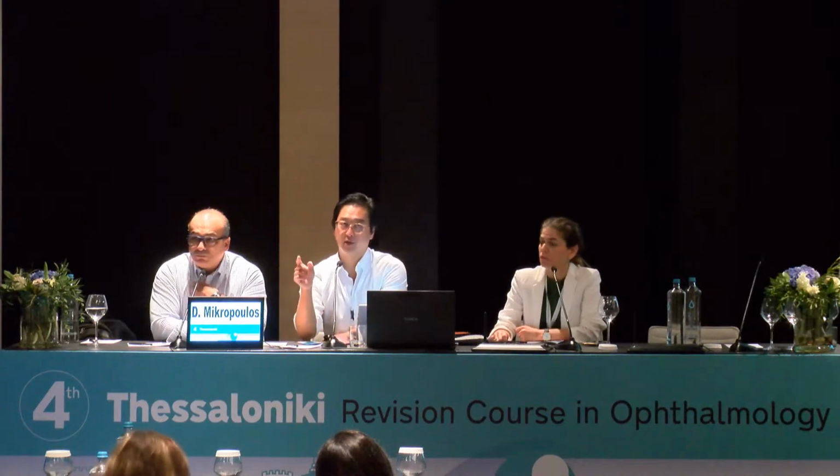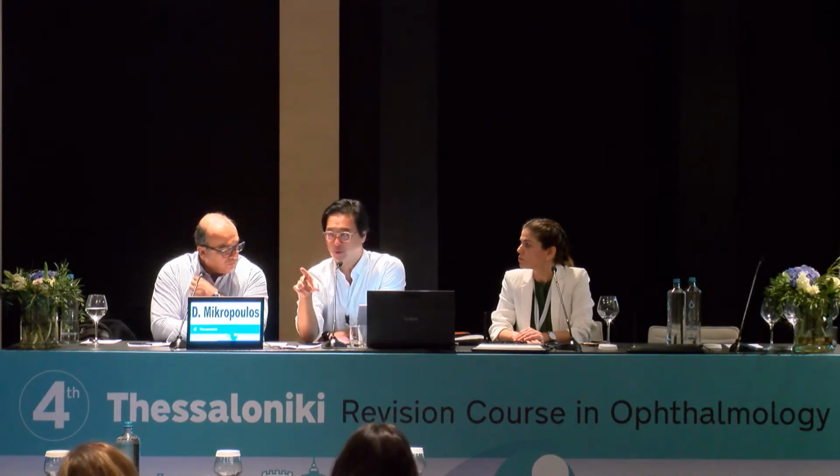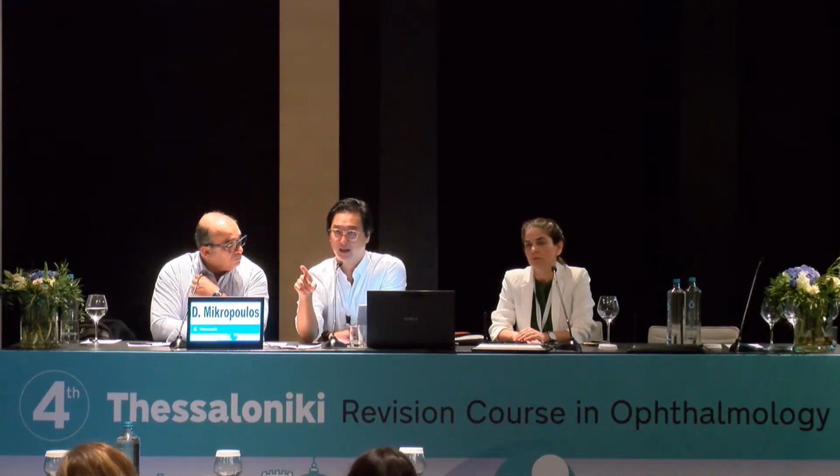Okay. Excellent. But there's another lady that asked a question there. I just want to add on one thing that you said earlier. I think there is a problem that a lot of practicing ophthalmologists do use OCT alone as a guide whether to treat or not a patient. And I'm quite wary of that. I think OCT abnormality can show up in high myopic patients and also other patients with a tilted disc. And as long as the visual fields are not matching the disc, there's no risk factor. Pressure of 24, abnormal OCT, so what? I wouldn't necessarily treat it just because they have abnormal OCT.